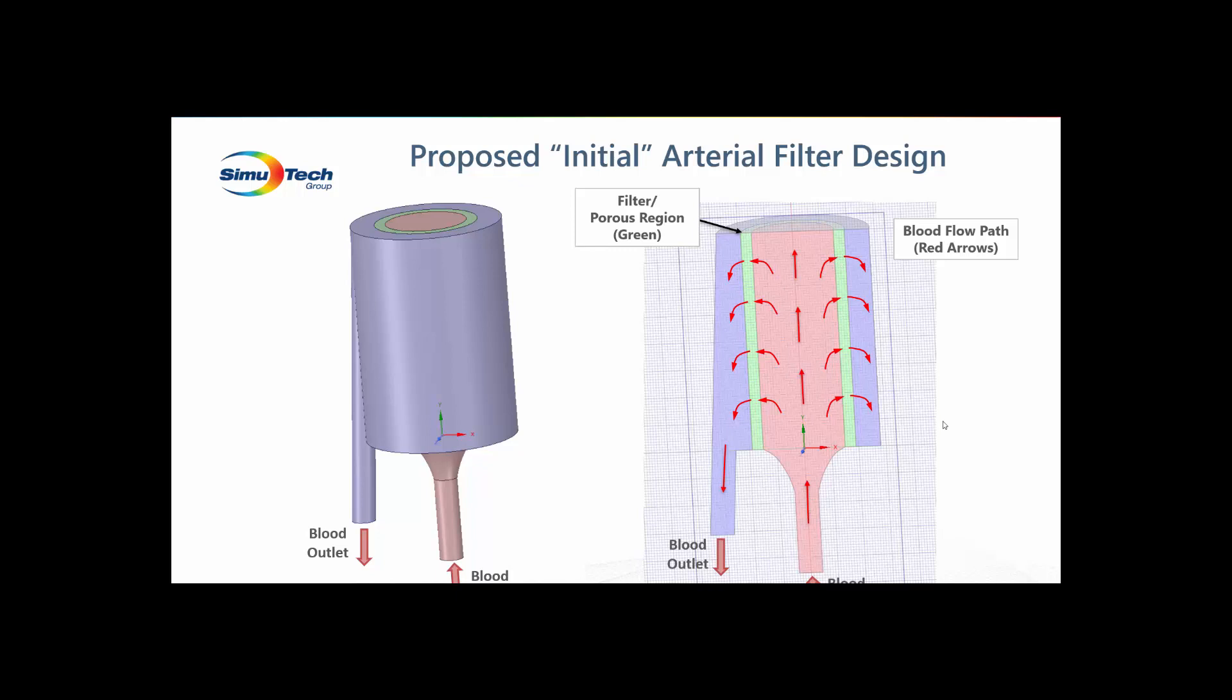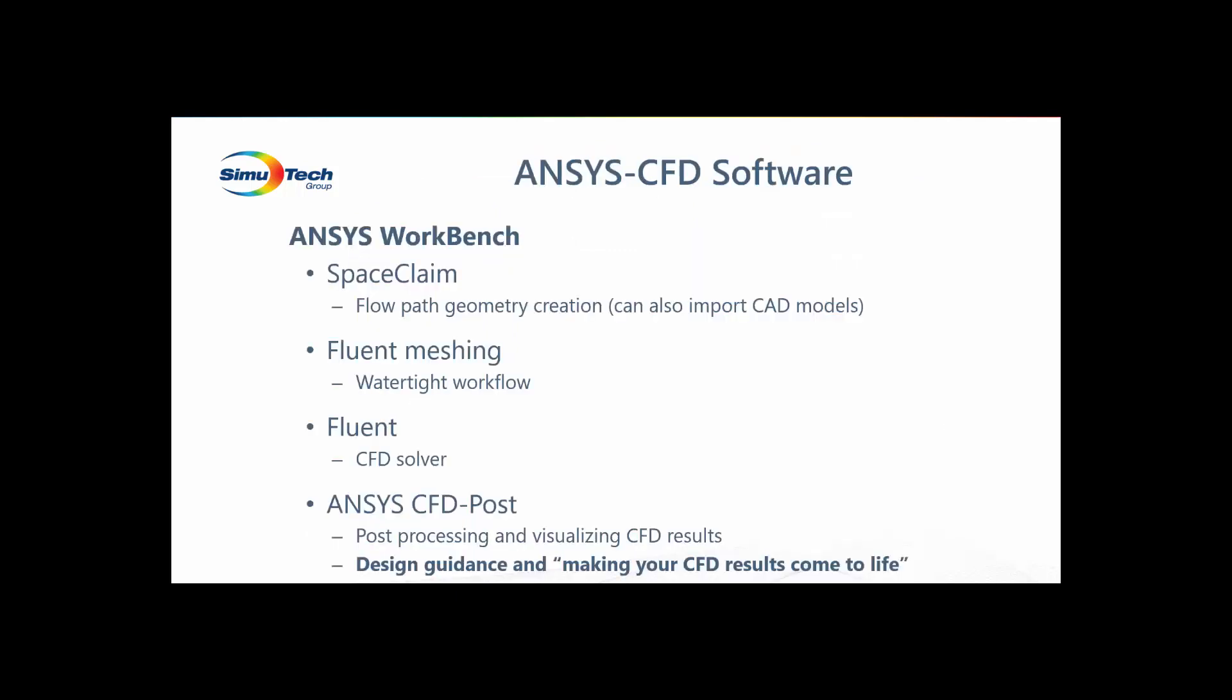We will be using the ANSYS CFD software which leverages the ANSYS Workbench overall platform. The components I'm using include Space Claim for creating the flow path geometry, or you can also import your CAD model, the new watertight workflow in Fluent Meshing, Fluent to provide the CFD solution, and ANSYS CFD Post to post-process and visualize the flow field results. I think CFD Post is where you can bring your solutions to life. You're exploring and sharing what you've discovered with your project teams or customers, and you're revealing what direction to take when making changes to improve your designs.